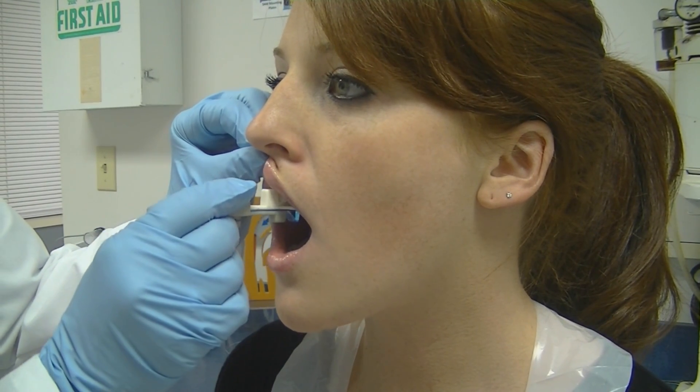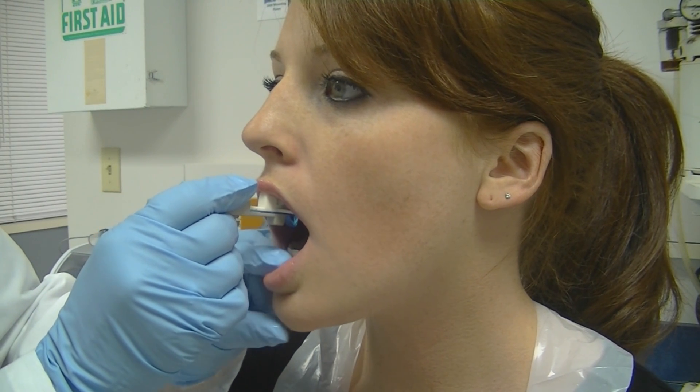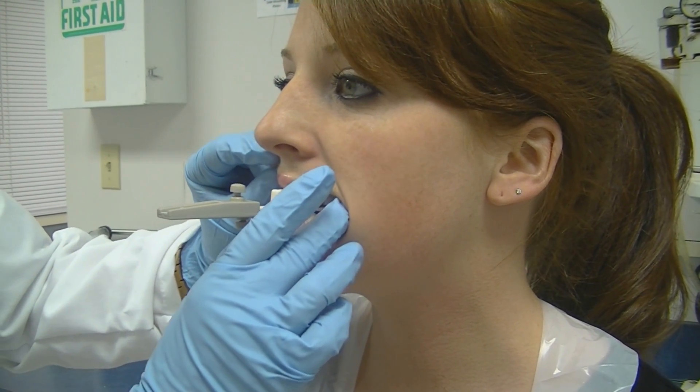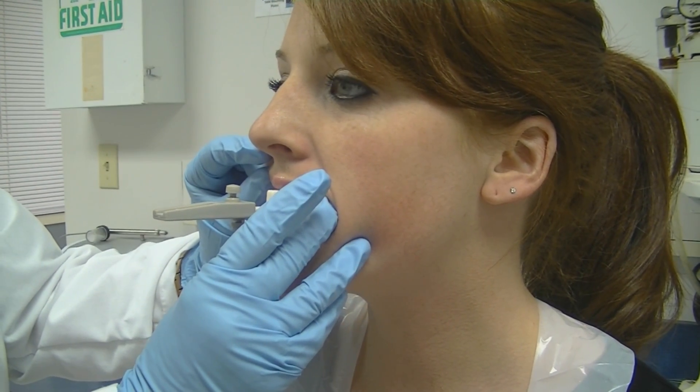On the white fork you will see a little indentation or etching that will help you line up your midlines. Make sure of this because it will definitely have an effect on your appliance if those midlines are off. However, if the patient has a natural deviation, it is always best to mark that on the prescription.